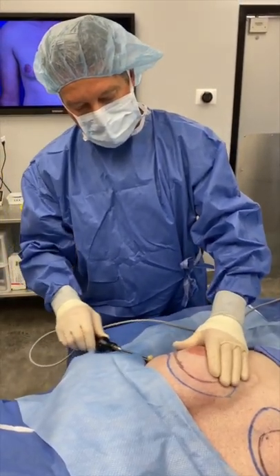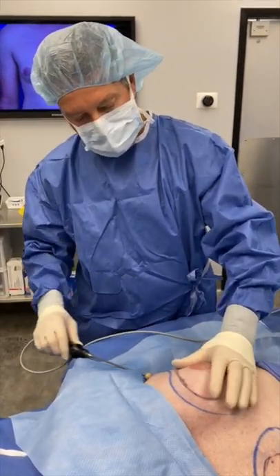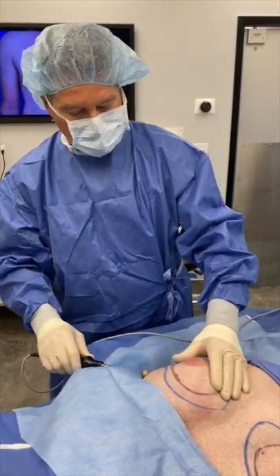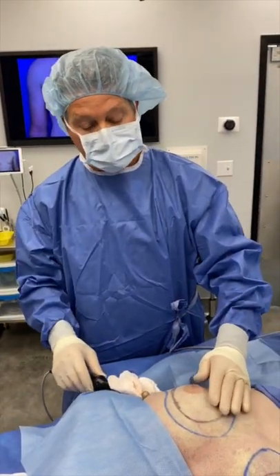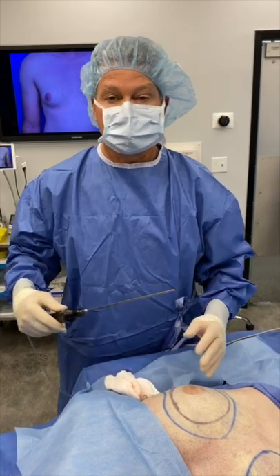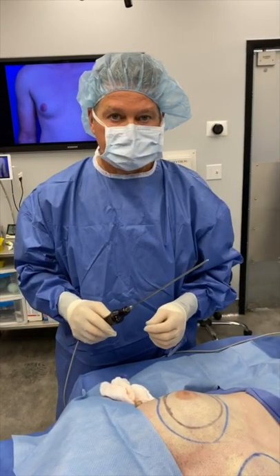If I'm going to treat extra areas, lateral in particular, that are really not gynecomastia tissue, I don't use the VASER system — I just use it up front for the actual gynecomastia tissue. The endpoint to treat this gynecomastia with the VASER system is determined by the time of application as well as the loss of resistance as I circumscribe the gynecomastia tissue.